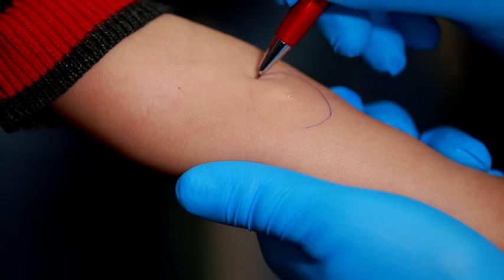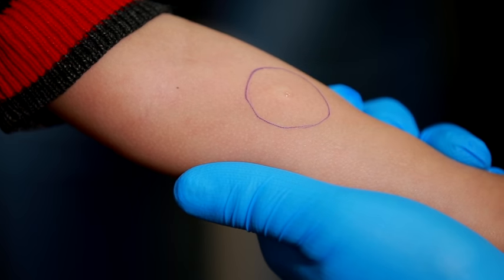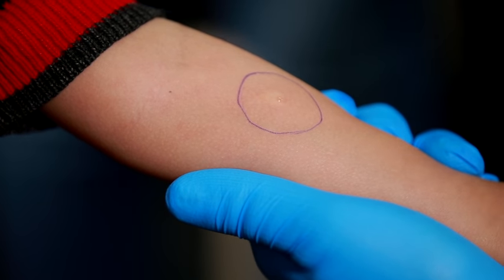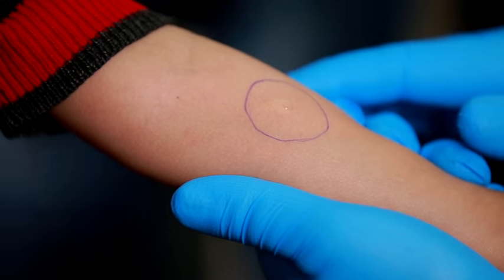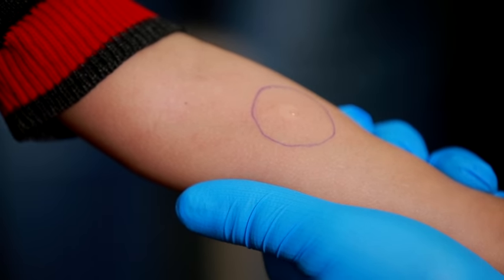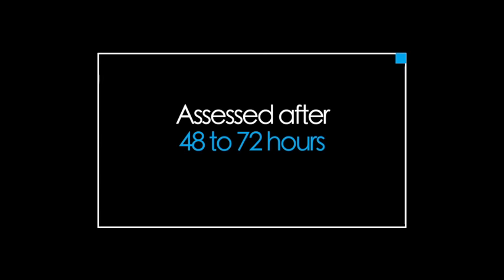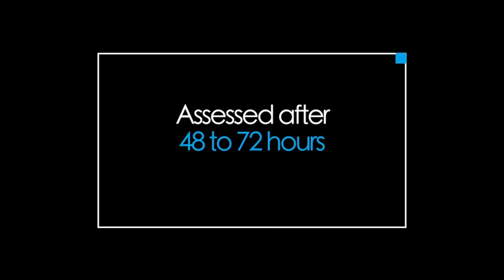Record the date, time, and site of TST administration. The patient should be advised not to scratch the site. The patient should be asked to return for a reading of the TST between 48 to 72 hours.